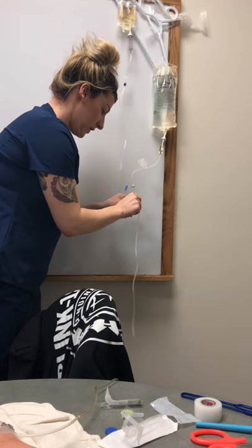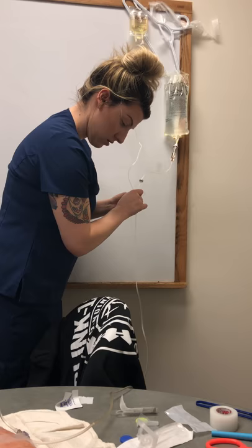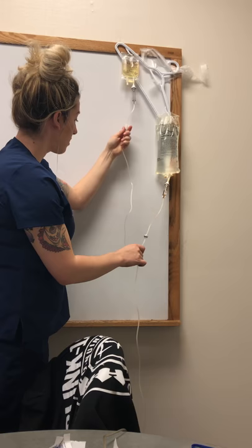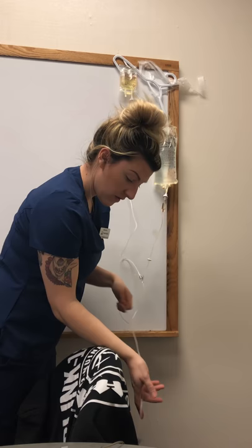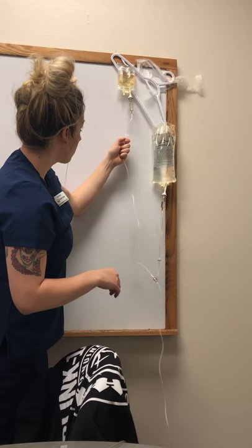We'd want to clean this little part that we're hooking up to. Make sure everything is open, squeeze this to make sure the drip chamber is full, make sure everything is open down here — and that's it.